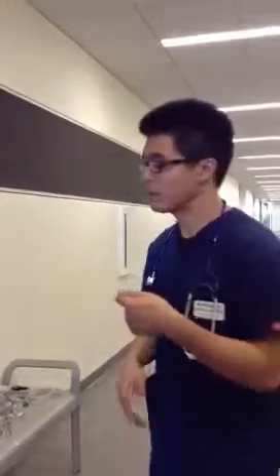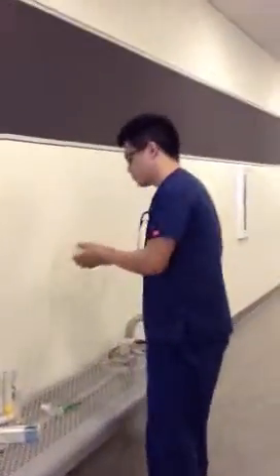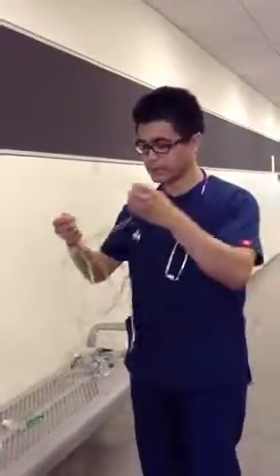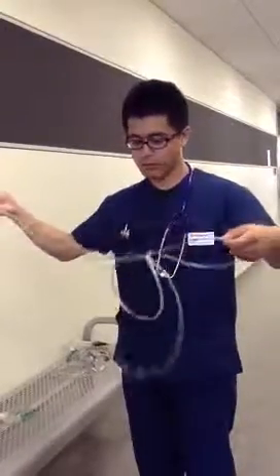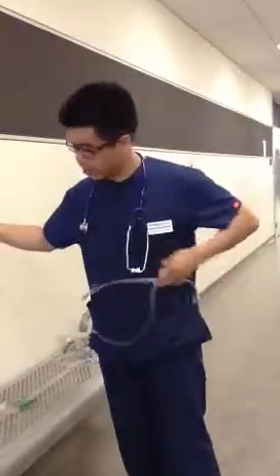Make sure that the bubbles are bubbling. Make sure you feel. Okay? So that's your look, listen, and feel. All you gotta do is listen and feel. Okay? You feel it. And you want to make sure there's no kinks.